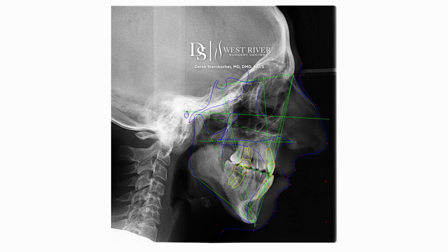Here's a cephalogram at the time showing, again, when you look at cephalometric numbers and we look at the SNA, SNB, and you look at the zero meridian line, how back the maxilla and mandible are compared to where they should be in space. The chin is long, the pagonion, menton are back too far compared to the teeth and the lip.